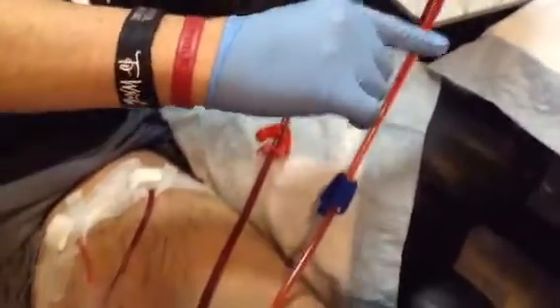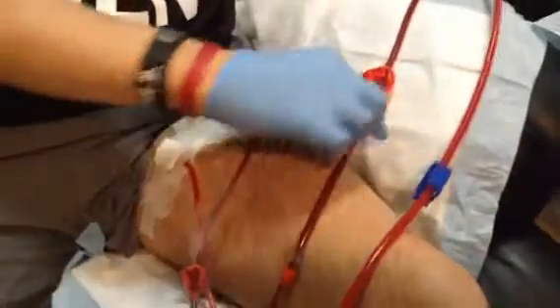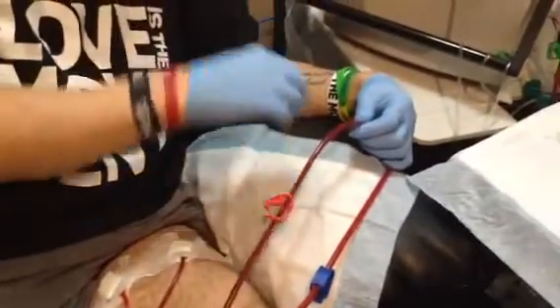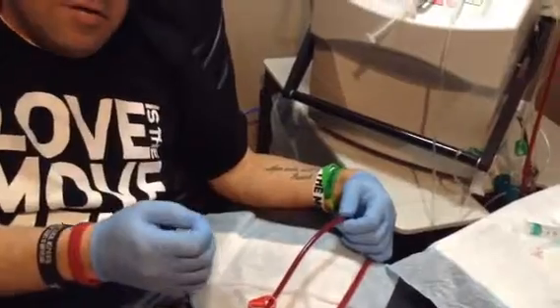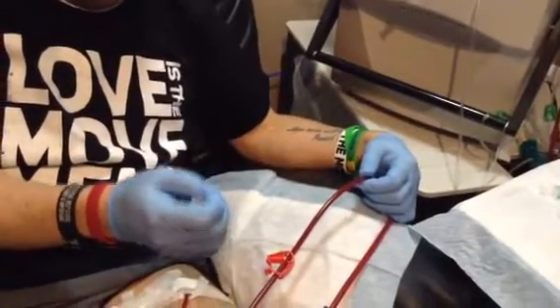The blood will come back — as you can see it's starting to turn redder, it's coming back into my body here. It basically comes out of my body, gets all cleaned out. Not completely clean — it's better to have a kidney obviously. This is five days a week for about three hours at a time, whereas a kidney works 24/7.